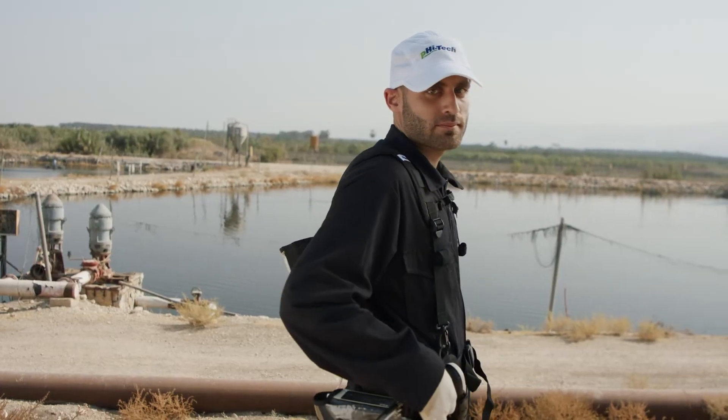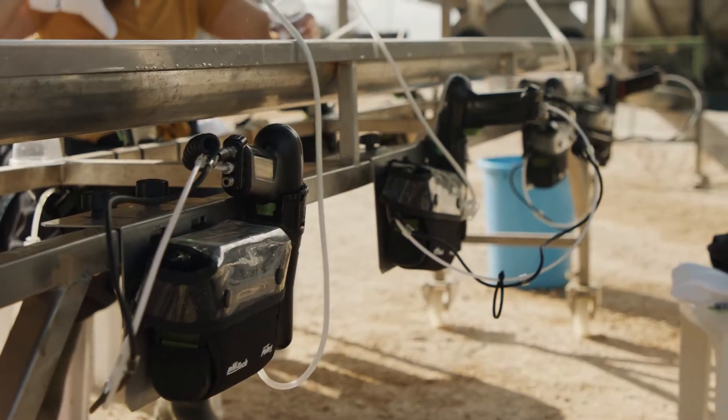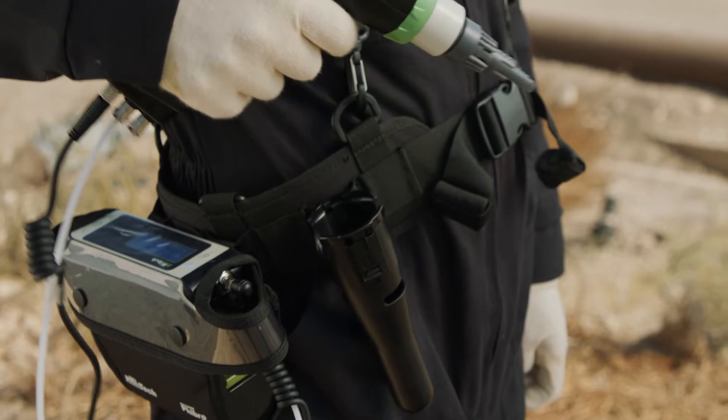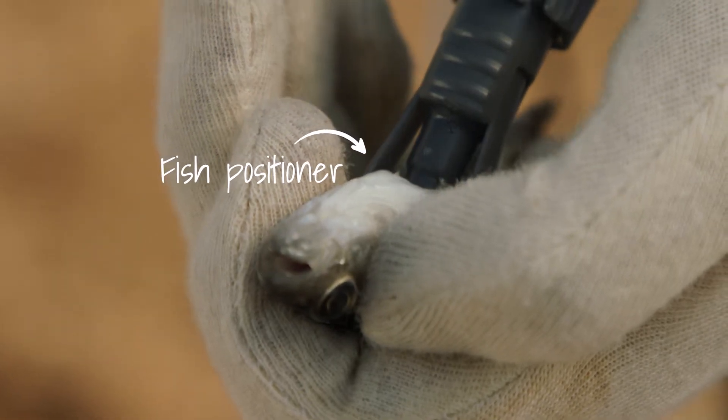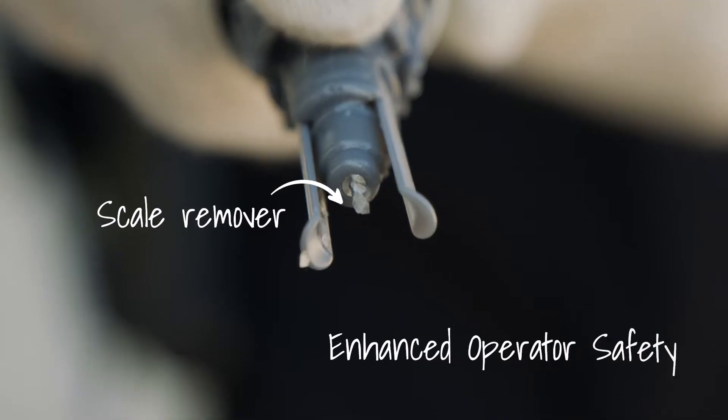Allowing teams to vaccinate virtually anywhere. This lightweight hand unit is specially designed for quick and easy injections, while increasing safety for everyone.